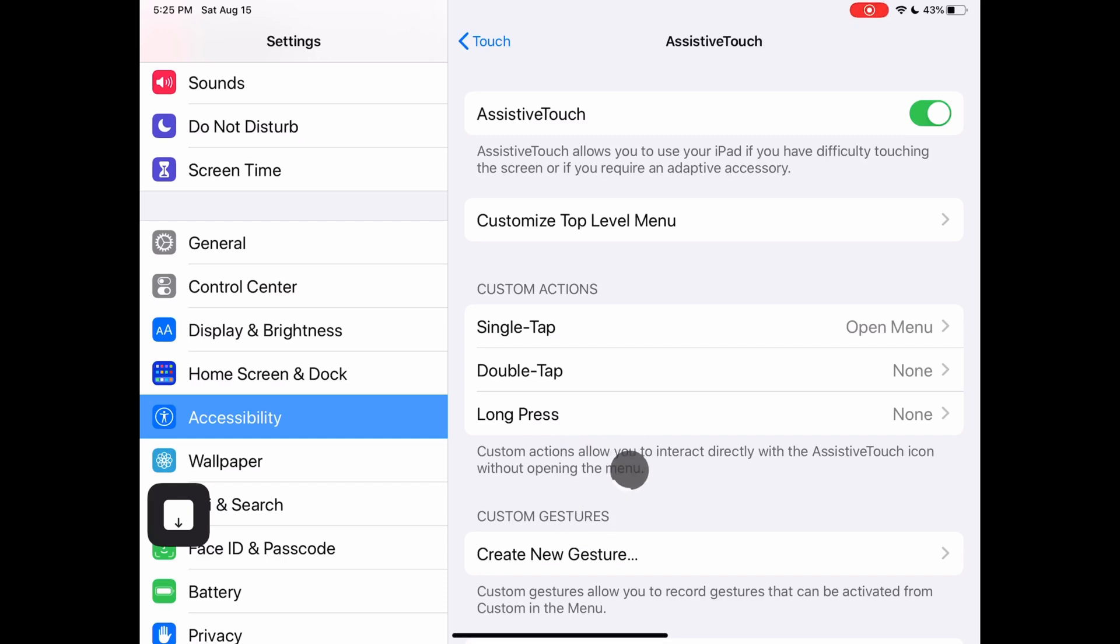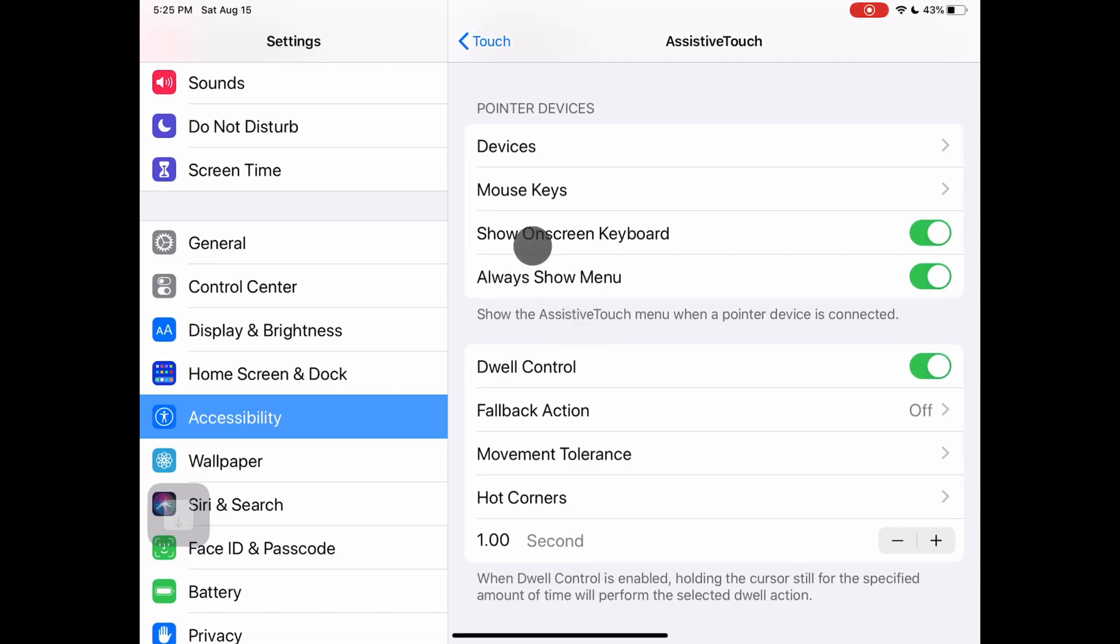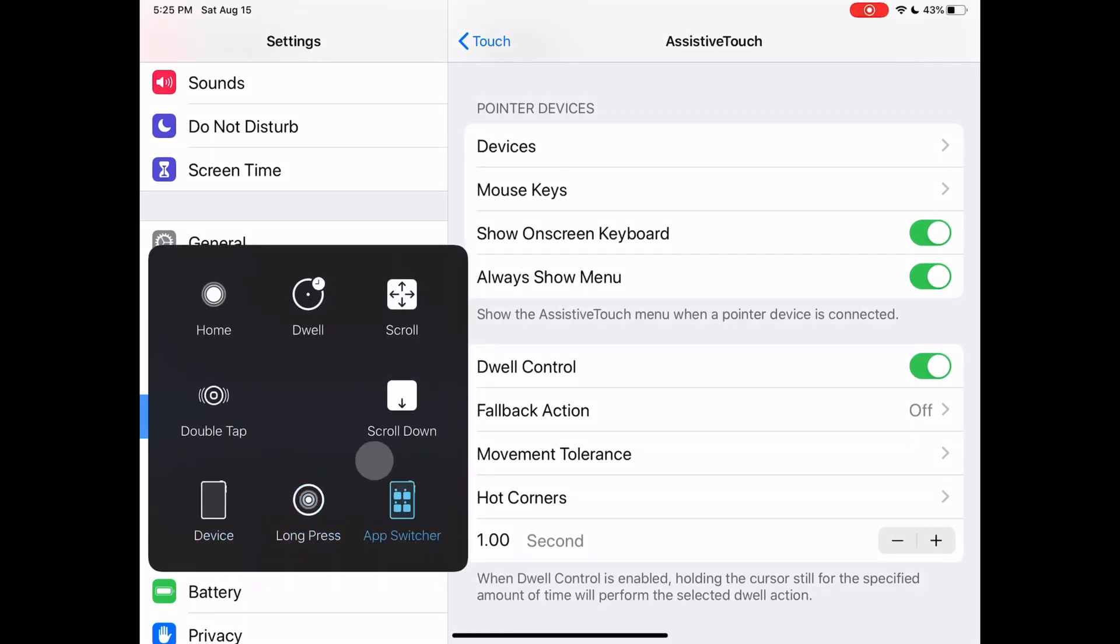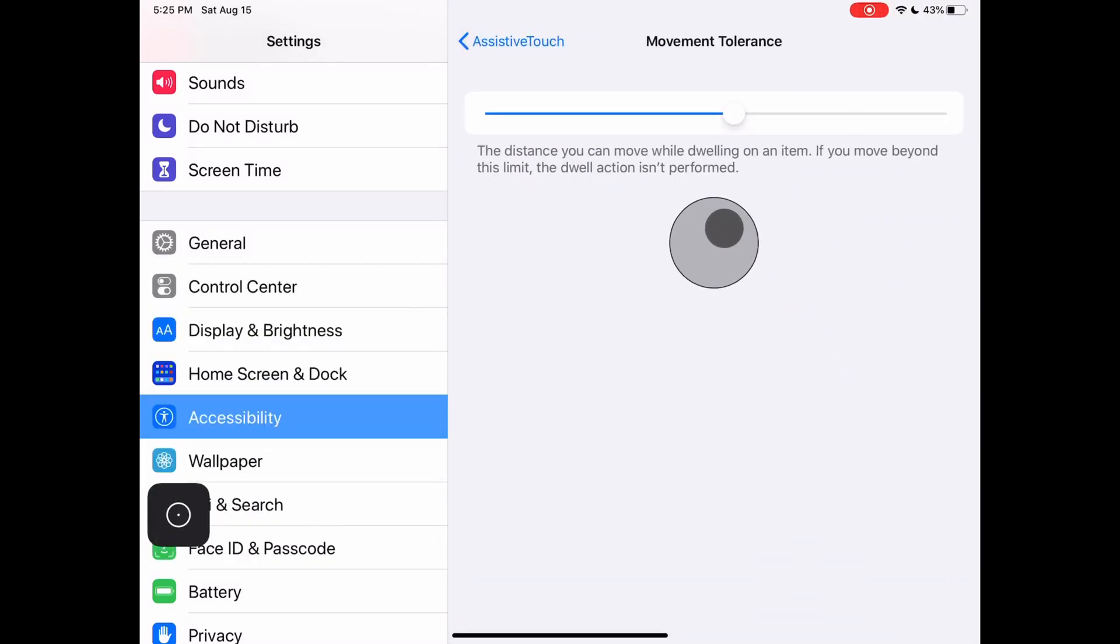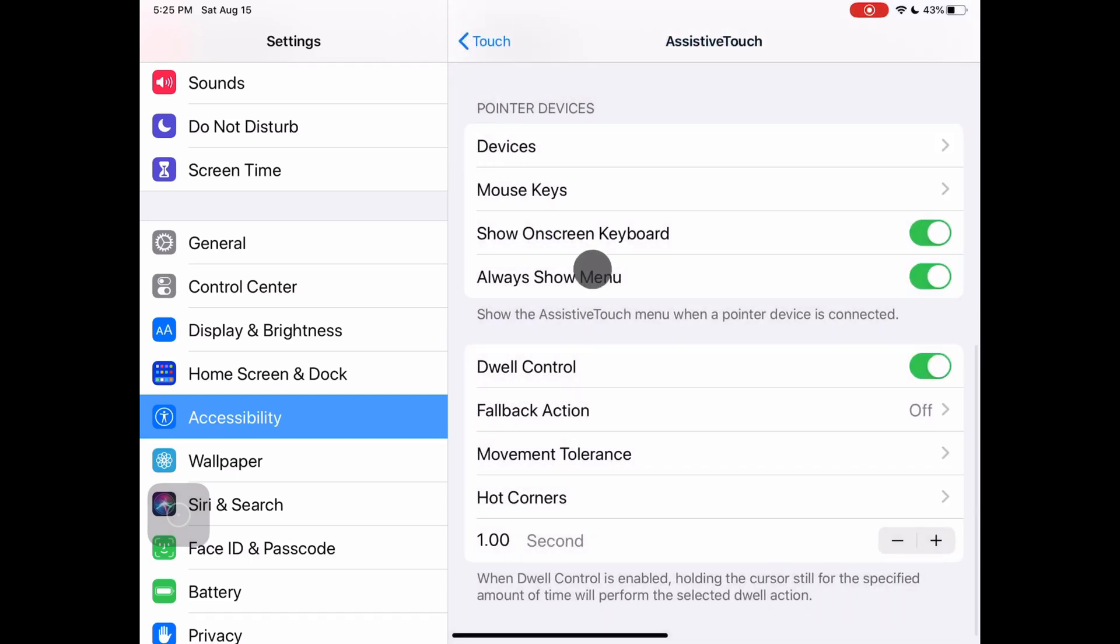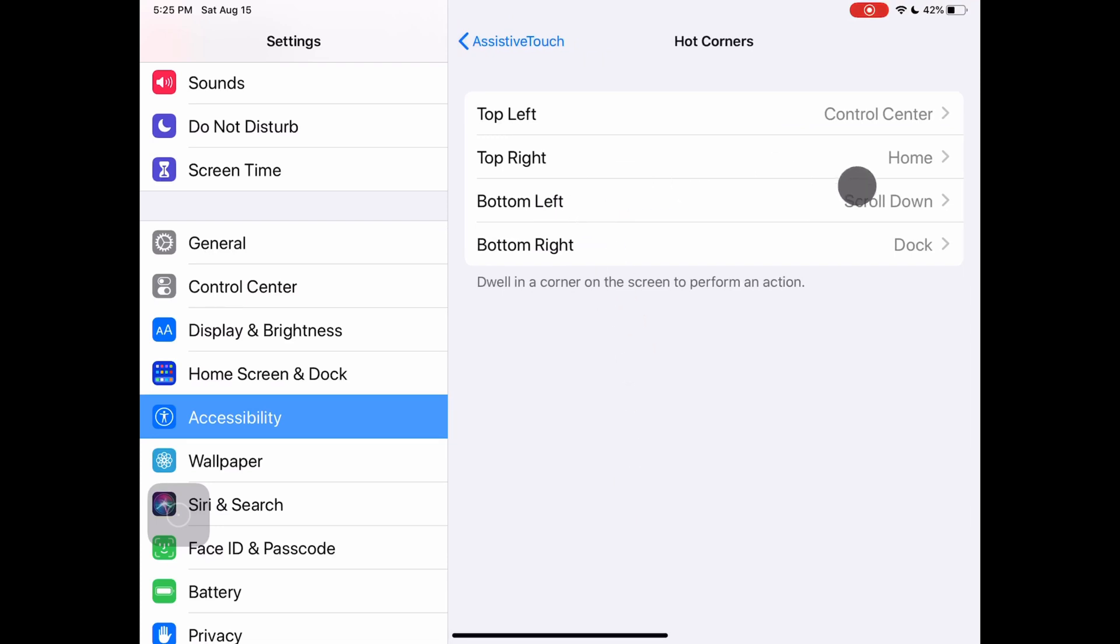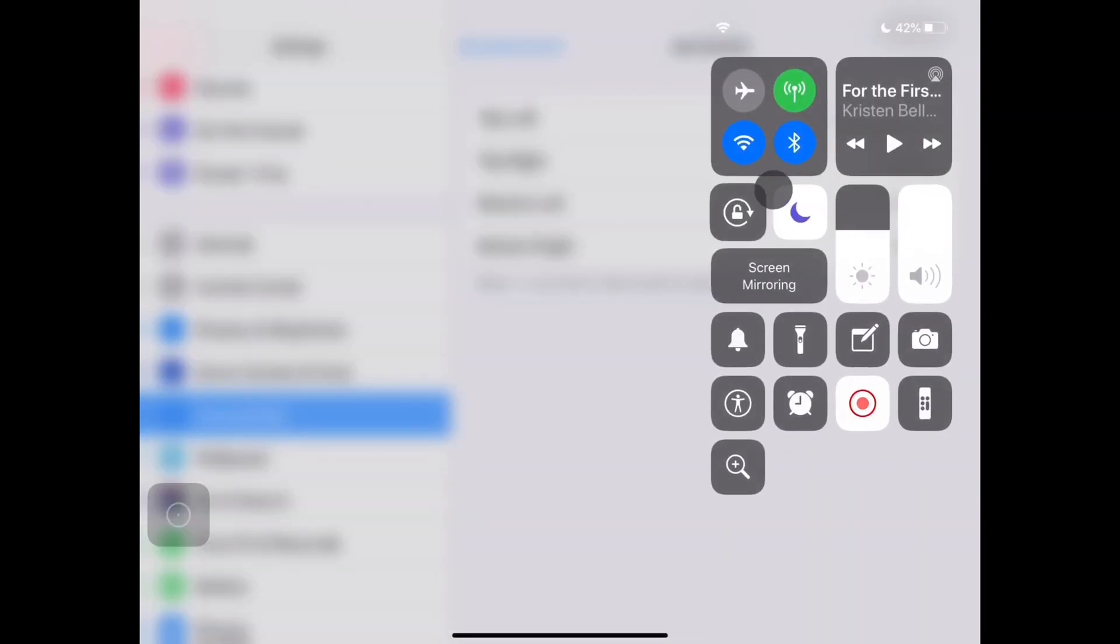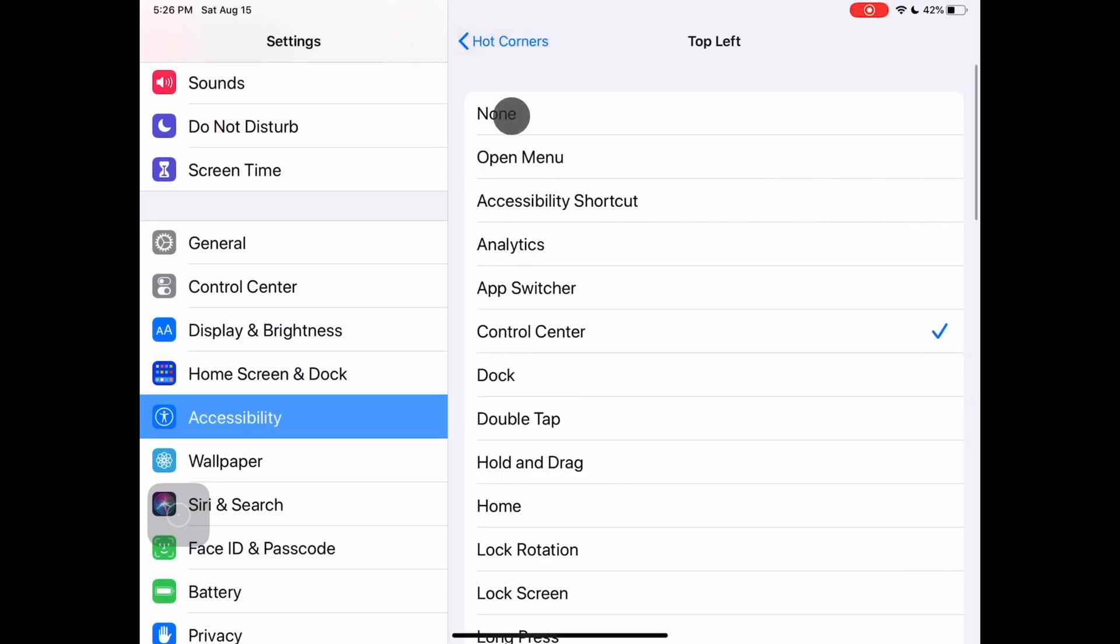The other important thing under assistive touch is the dwell settings. You can set the time it takes to tap. Movement tolerance sets how far the cursor can move when trying to tap. Hot corners could be really useful. It allows you to assign menu commands if you dwell in the assigned corner. So if I go to the top left corner it will open the control panel. Unfortunately the scale is not always accurate when aiming for the corner or edge. They are making constant updates which is key to keeping up with the iPad. So I am hopeful for this feature.